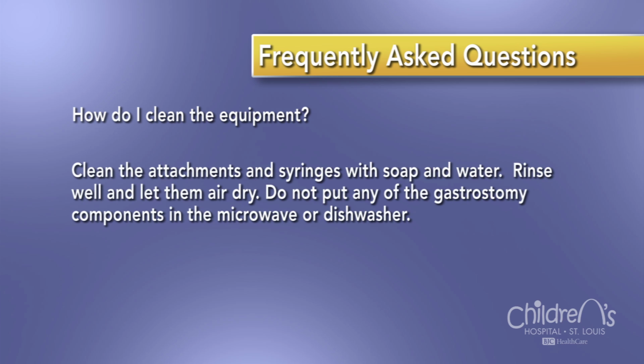How do I clean the equipment? Clean the attachments and syringes with soap and water. Rinse well and allow them to air dry. Do not put any of the attachments or syringes in the microwave or dishwasher.